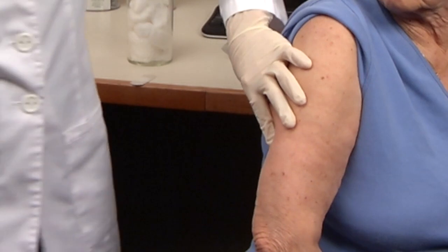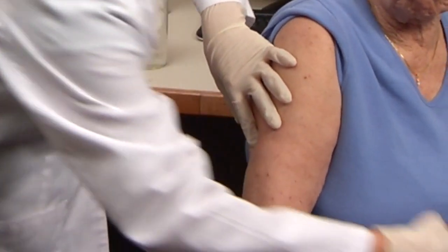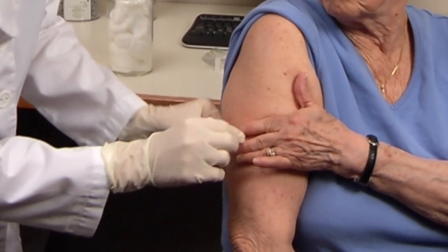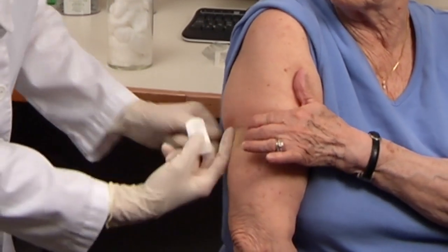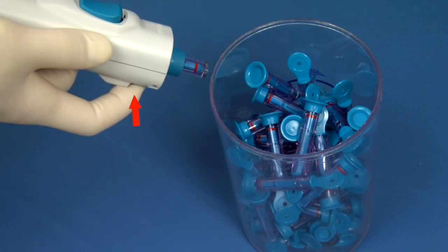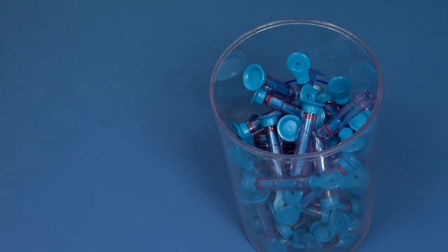Immediately apply pressure with cotton or gauze to the injection site for approximately 60 seconds, and then apply an adhesive bandage. Removal of the syringe from the injector is accomplished by pressing inward on the ejection button under the injector. Dispose of the used syringe per standard procedures. It is not necessary to recap the needle-free syringe prior to disposal.